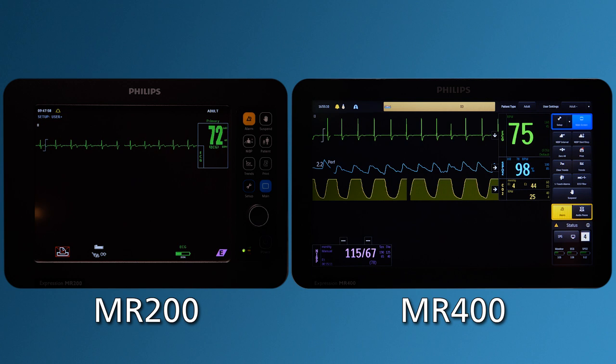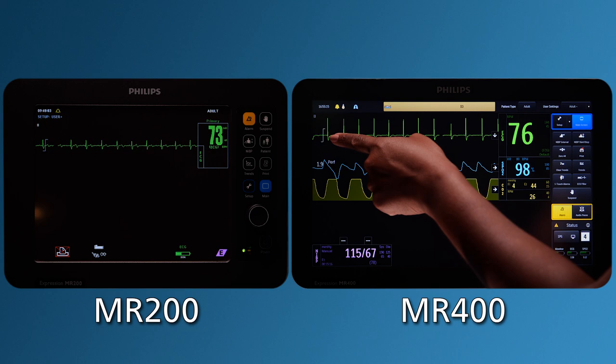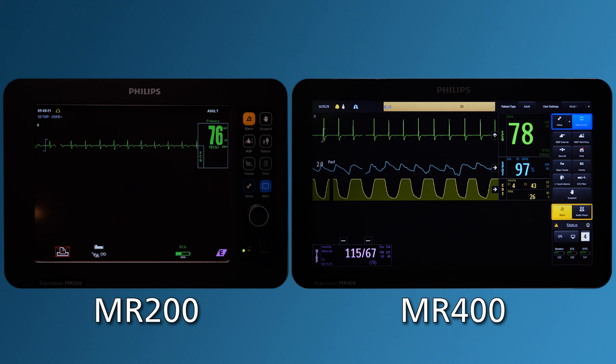Once you have placed the electrodes, you will want to review your ECG waveform for signal strength. Refer to the ECG reference line on the monitor to see if you have good signal strength and minimal artifact. For the MR400, the ECG signal should be at least 1 millivolt, that is, the waveform should be equal to the size of the scale indicator.